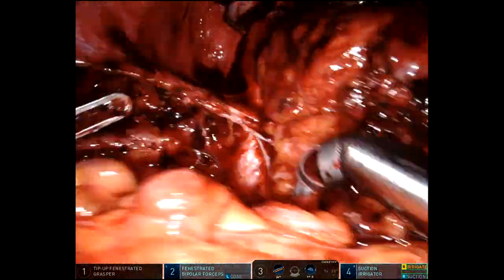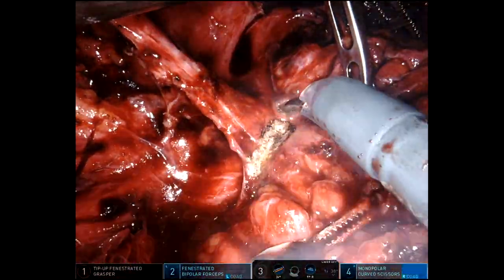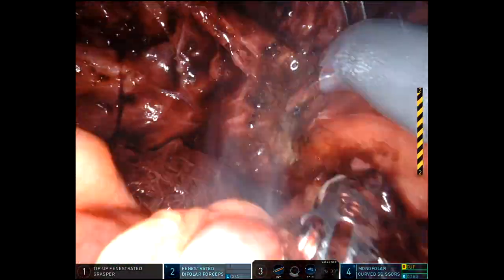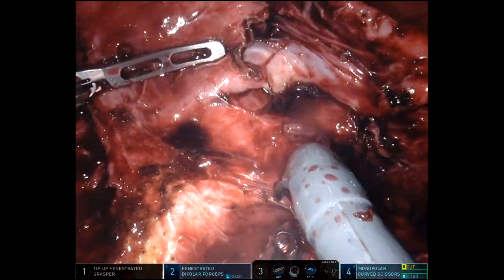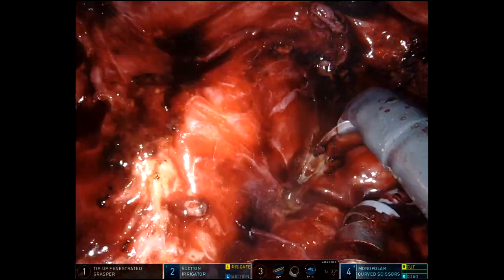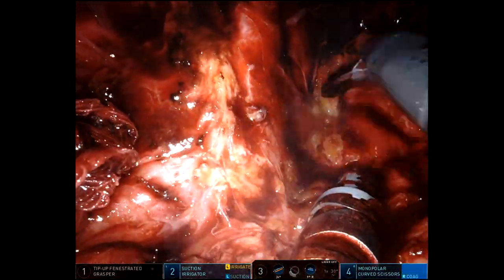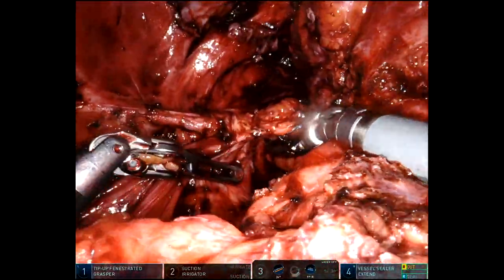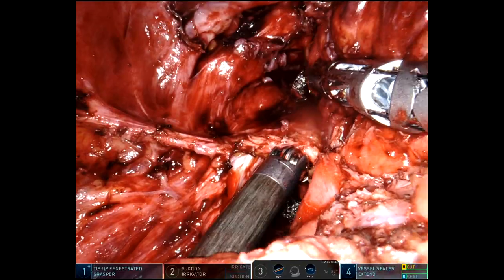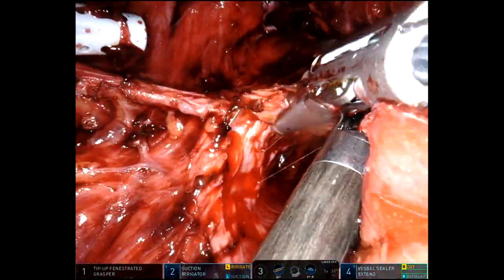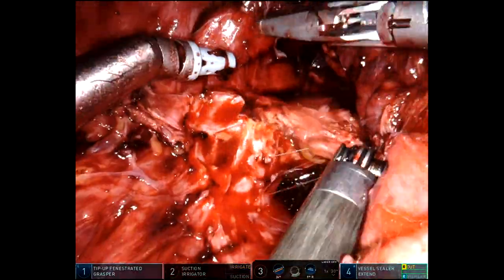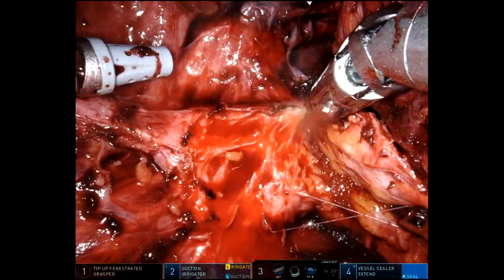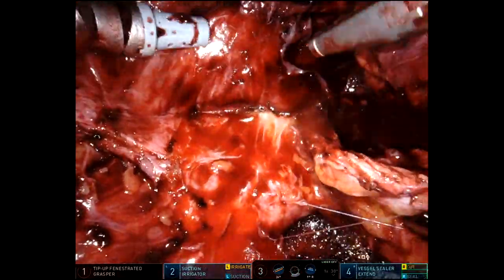This is the area I was having trouble with before, with concerns about where the ureter was. I'm carving through this with scissors because I really can't find a good plane. I'm trying to err towards the colon to make sure I'm not bringing any of the left pelvic sidewall or branches of the internal iliac into my dissection plane. I can finally see a little better but I'm still doing as much blunt dissection as I can, making sure I don't have any thermal spread to the ureter.